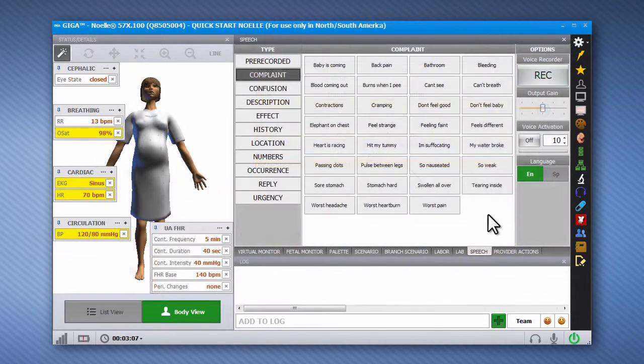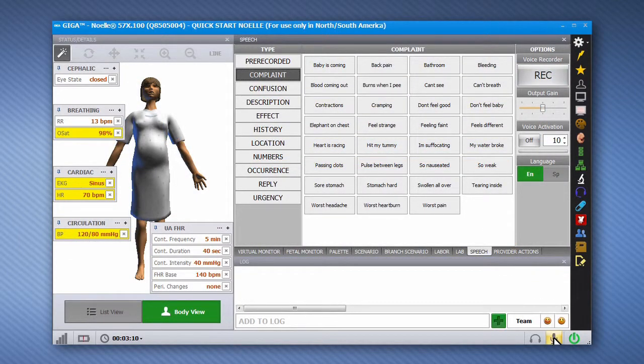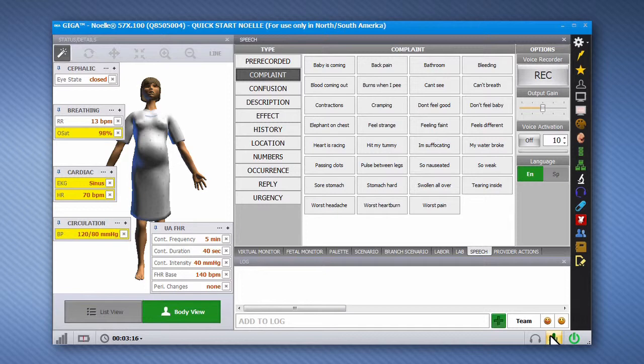Noelle is equipped with a built-in wireless streaming voice feature that allows the operator to speak to the participant as the patient's voice. Participants can respond directly to Noelle and maintain a real dialogue throughout the simulation.